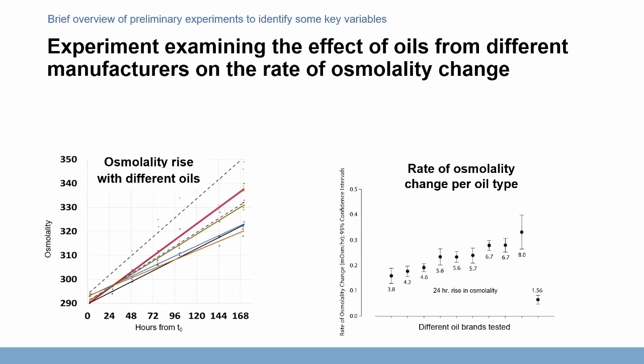Now, I had previously performed experiments under similar conditions, but in a humidified incubator. The expected rate of change in the humidified incubator is notably lower than any of these particular oils. I don't like to use things like brand of oil as a fundamental parameter in a scientific sense, because it's really not very scientific.